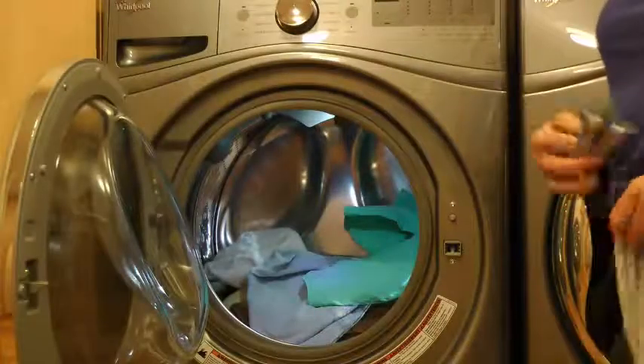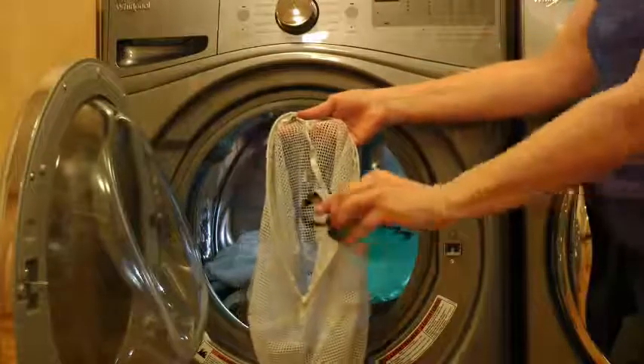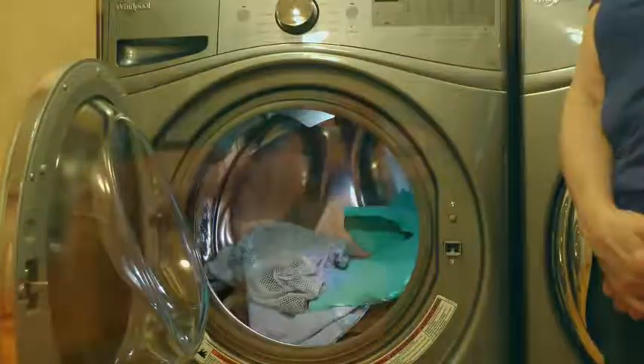Or, if you prefer, close the straps and wash your Metagrip in the washing machine in a net bag up to 104 degrees Fahrenheit or 40 degrees Celsius. Use the delicate cycle and allow to air dry.